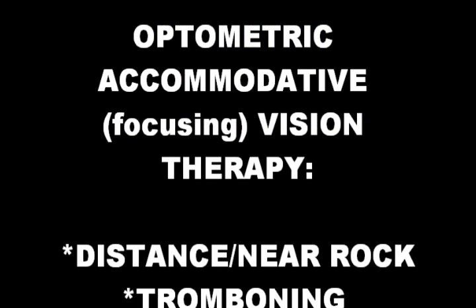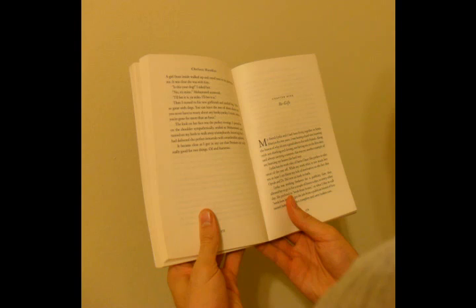At this time, you have all the information you need to work on and improve your accommodative range and speed. Remember, efficient accommodative skills are important for performing near tasks like reading and writing.